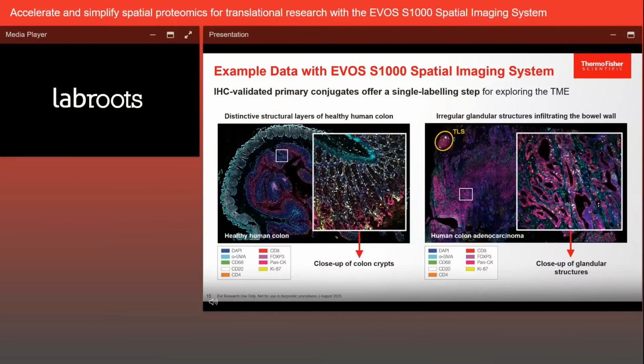We know from the quantitative studies that we have performed that there is also almost a 10 times increase in the percentage of macrophages in these samples, and we know that they contribute to cancer-related inflammation. We also know that there are more FOXP3 cells and CD4 cells that you can also appreciate from the image.